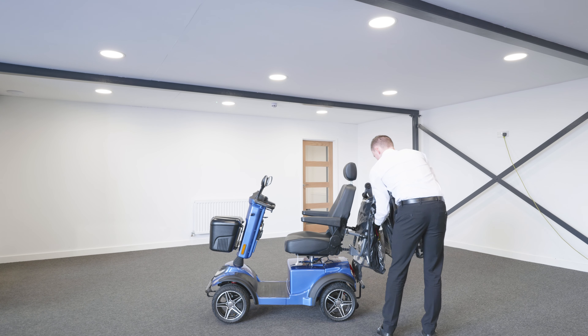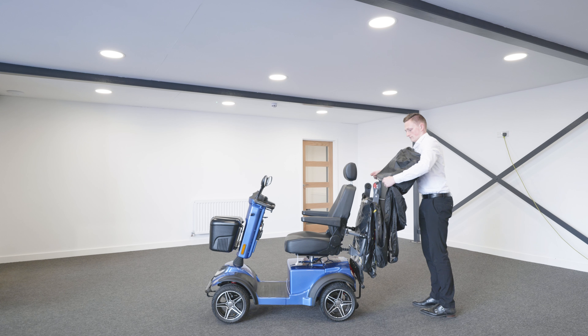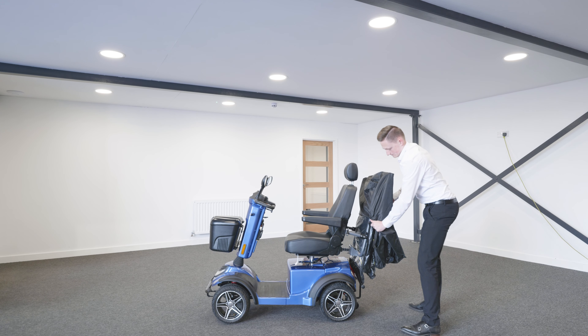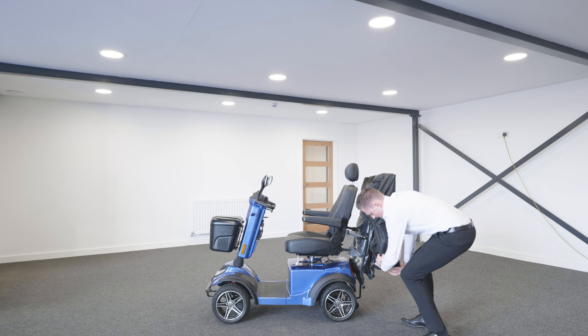Finally, place the protective cover over the canopy and its frame. Now you can stay warm and dry on your mobility scooter with the Universal Scooter Pack Canopy.